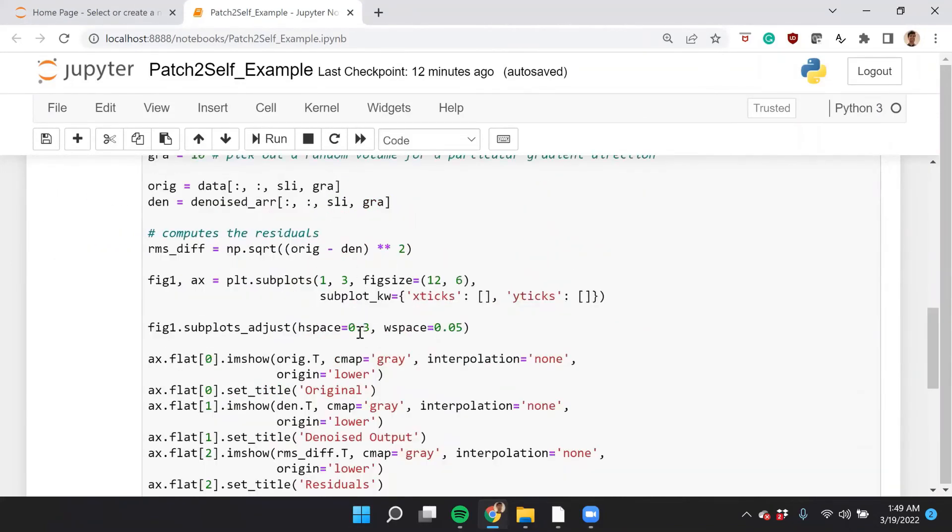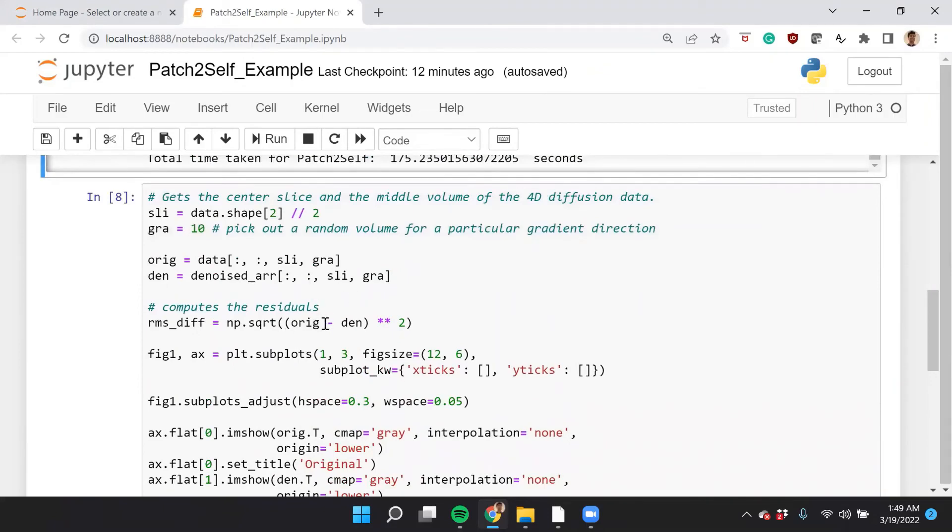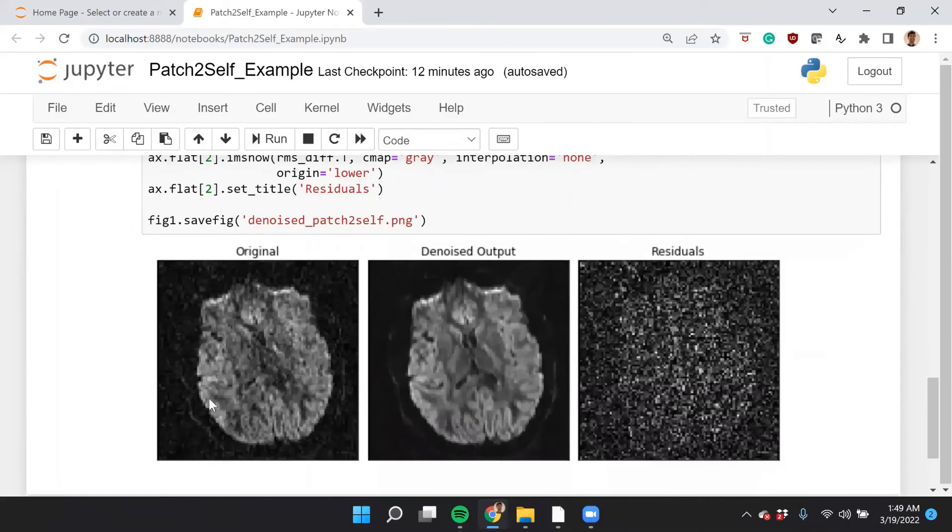And next we show the output. So for example, you can use in the DIPY tutorial, we have this example of how to see the denoising performance. And this is your raw image. This is your denoised output. And you can see the residuals over here. As you can see, the residuals do not have any signal components in them and does not really suppress signal. It's just basically noise.